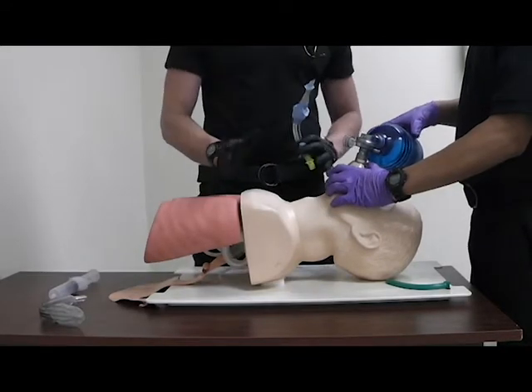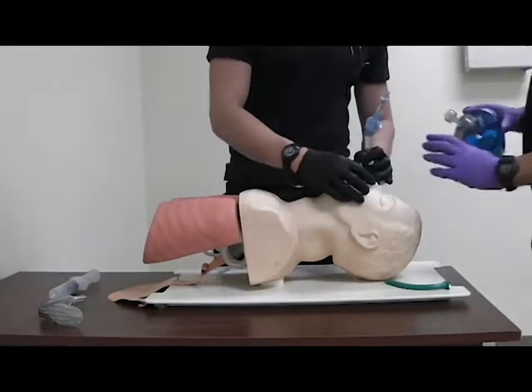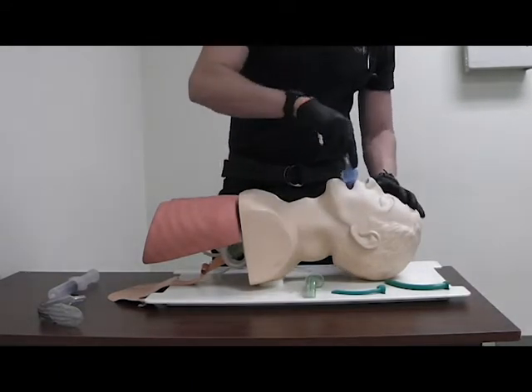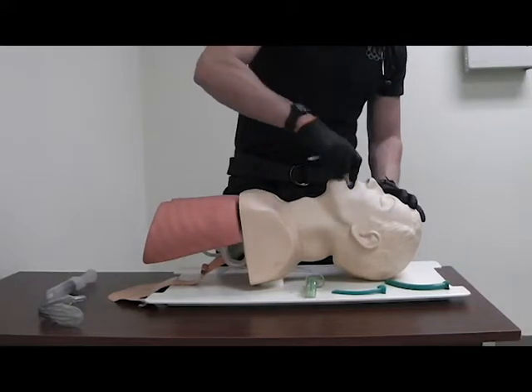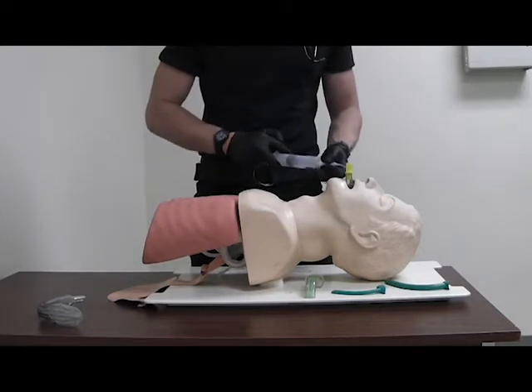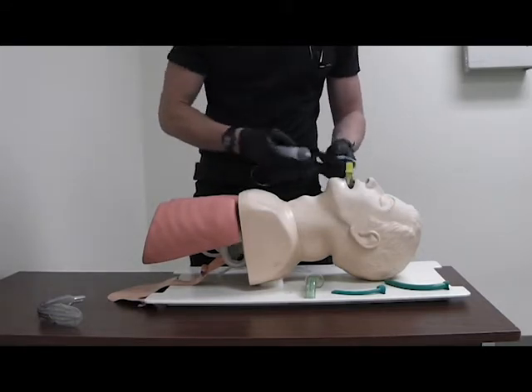Instruct your partner to stop bagging, remove the airway adjuncts, and with a lubricated KING, insert to the level of the teeth, then re-inflate.